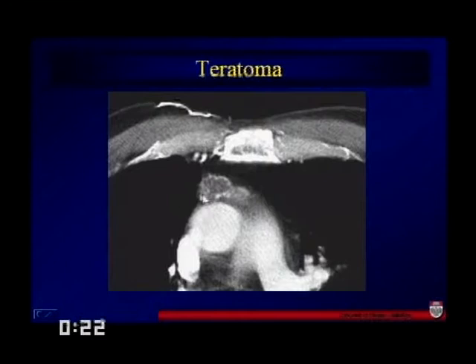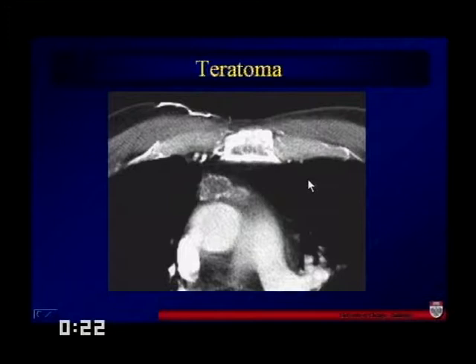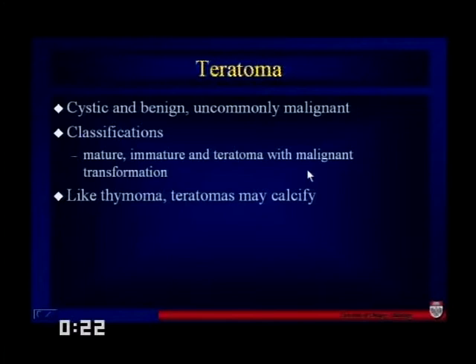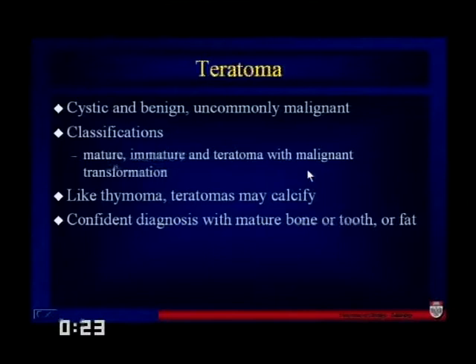This is a teratoma — a little irregular, but you can see there's not only some calcification in it, but also some lower density fat content. This is an anterior mediastinal mass which is a teratoma. Teratomas are uncommon. They can be cystic and benign, may calcify, and may become malignant over time. You can make a confident diagnosis if you clearly see tooth or bone material or fat. That wraps it up for teratoma.